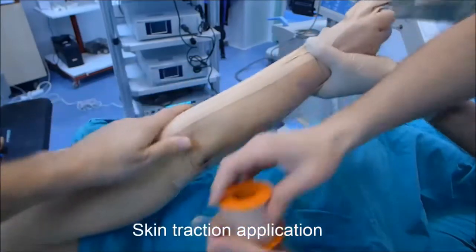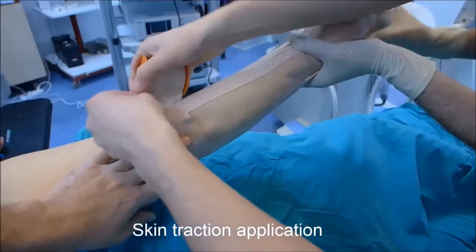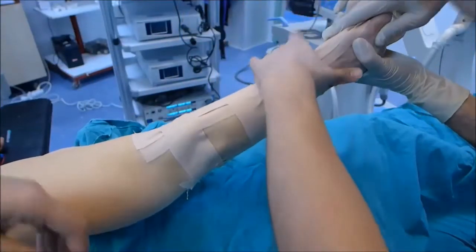Then reinforce the tapes with three semicircular bands applied to the dorsal aspect. Care is taken to leave the volar surface of the forearm untaped to avoid circulatory impairments.